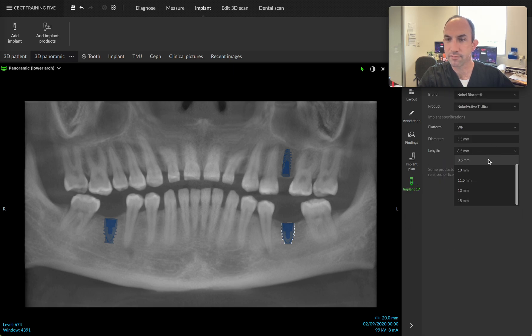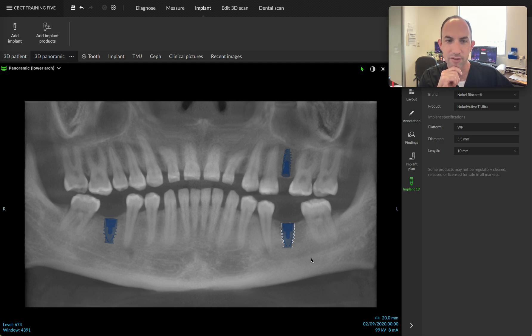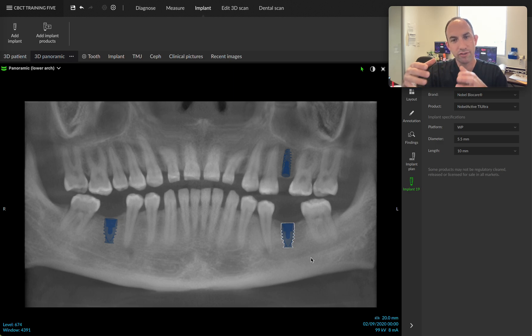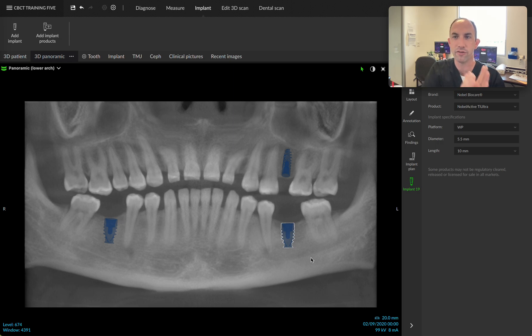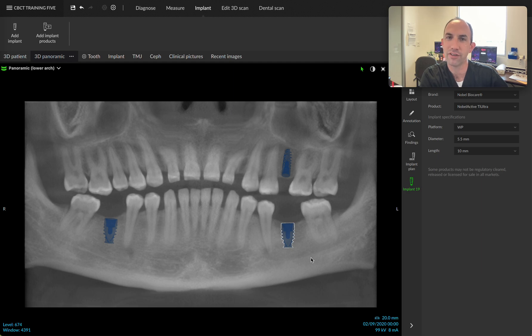On second thought, we're going to make this back to 10. That might be a little close, but we'd certainly take a depth x-ray with one of the parallel posts and see exactly where we're placing that, and maybe back away from anything too deep. I read a great article about how with wider dental implants, as we get more posterior, we ought to try to use a wider implant — it gives a better emergence profile and less chance of food impaction under those lollipop-shaped abutments. I've always been a one-size-fits-all type with regular 4.3 by 10 or 11.5, but for first and second molars, we ought to try to put in wider implants for a much better emergence profile and more cleansability.